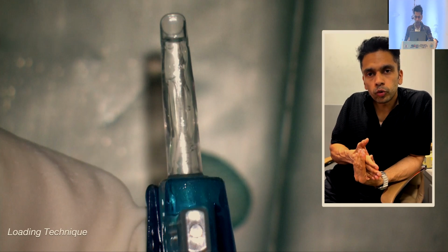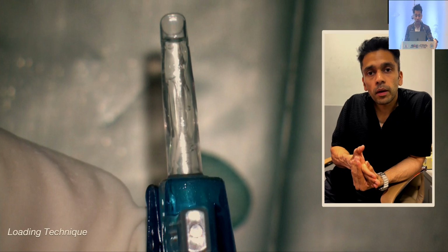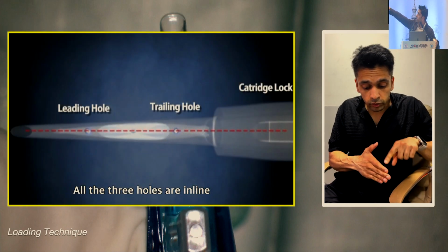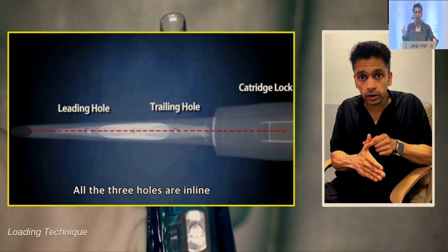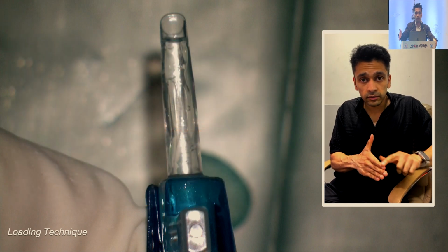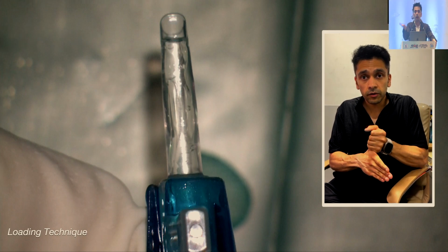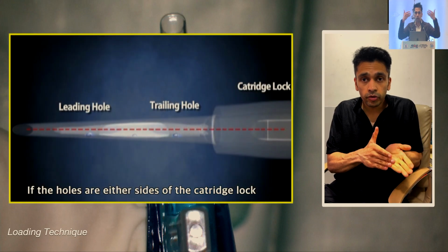So use that. I'm going to shut this off, but the basic idea is to use the reference point of this cartridge lock which you're seeing over here. The cartridge lock is your only reference point when you're inside the eye. Use that to pivot left or right and make the holes face you at all points of time.